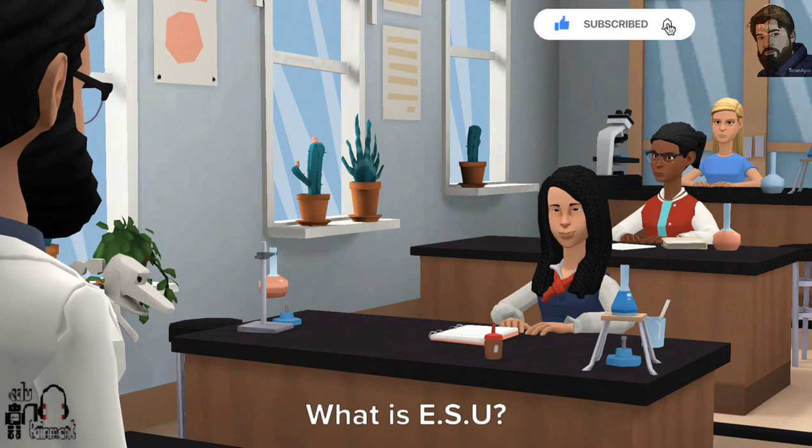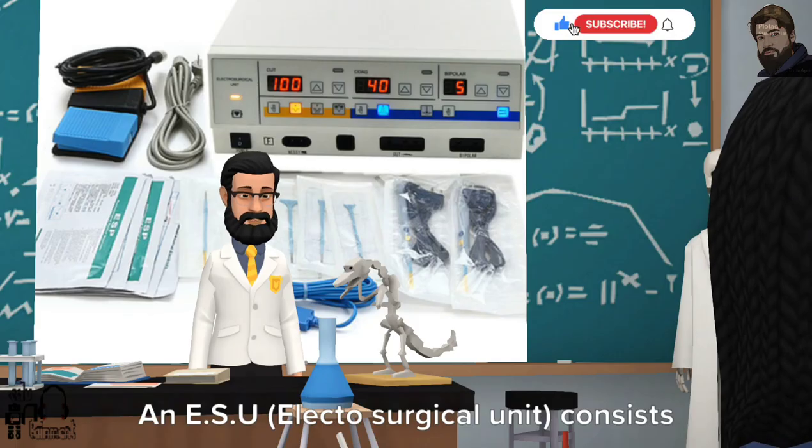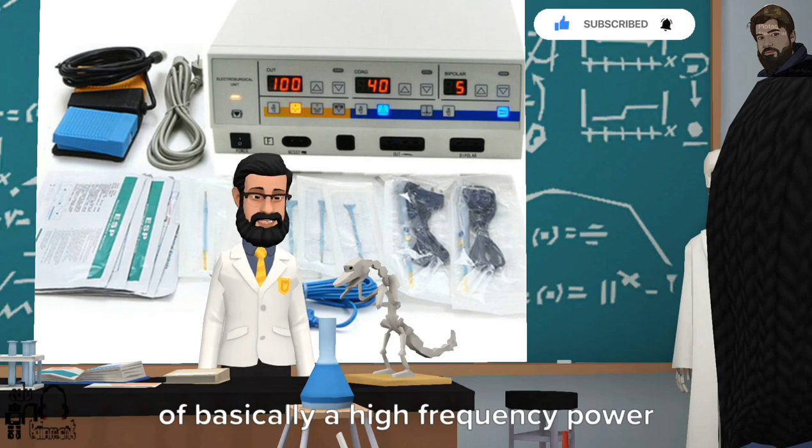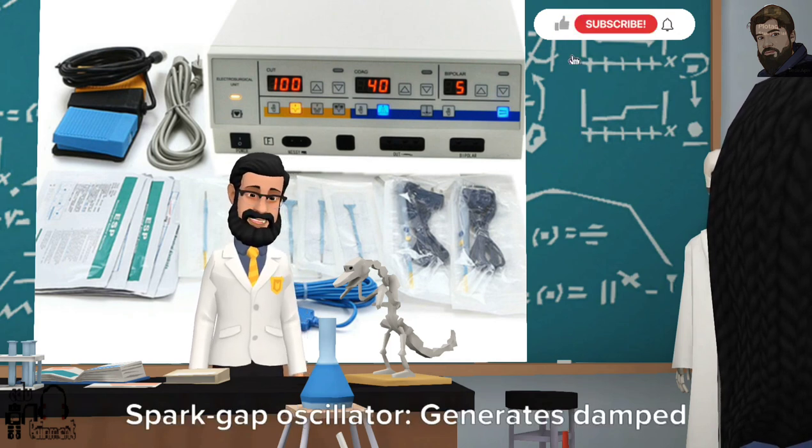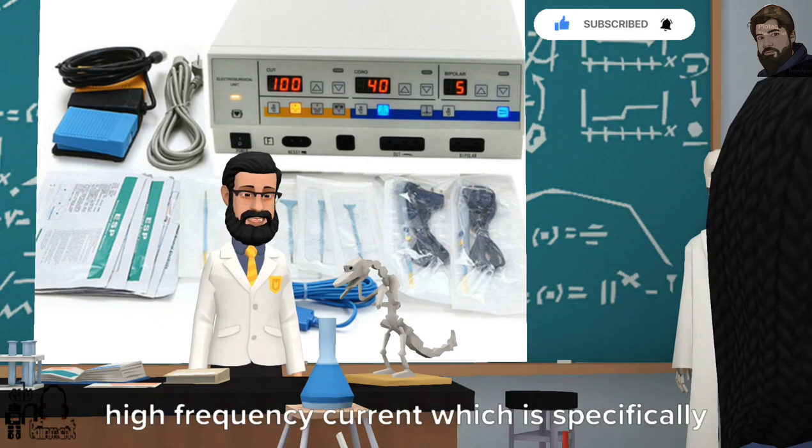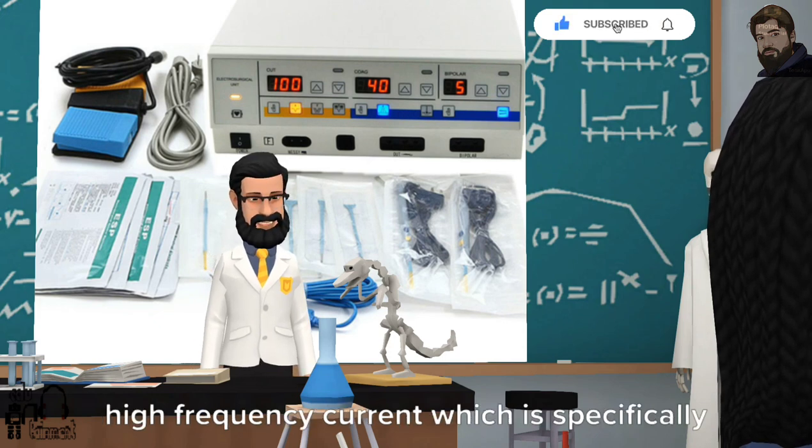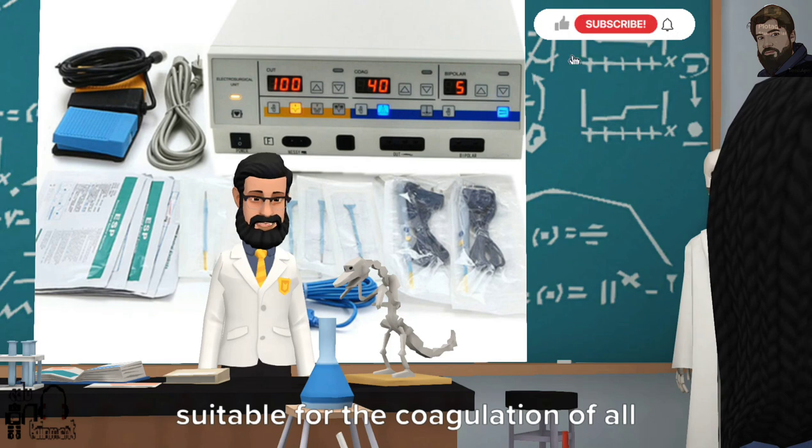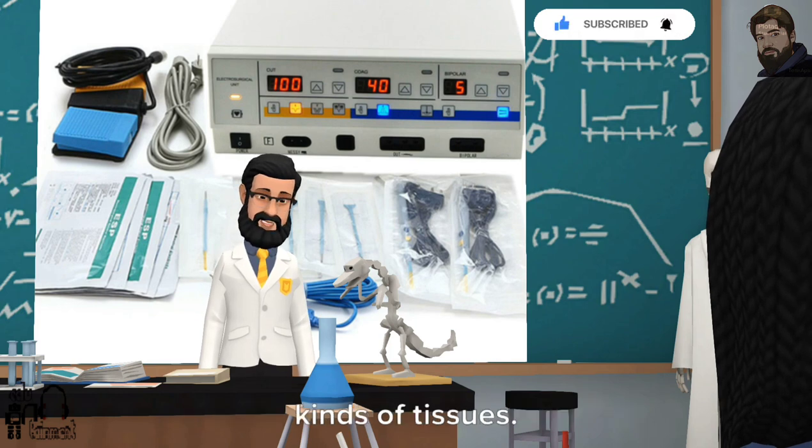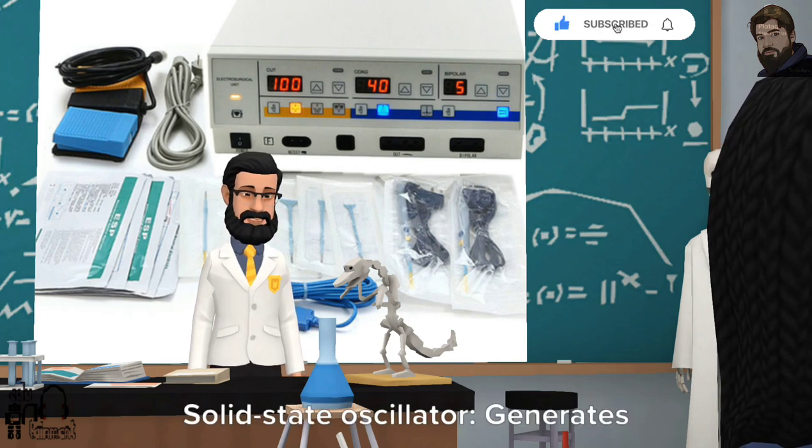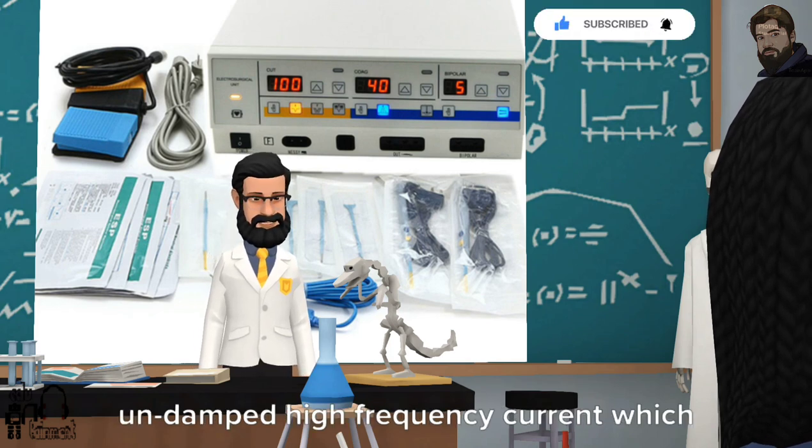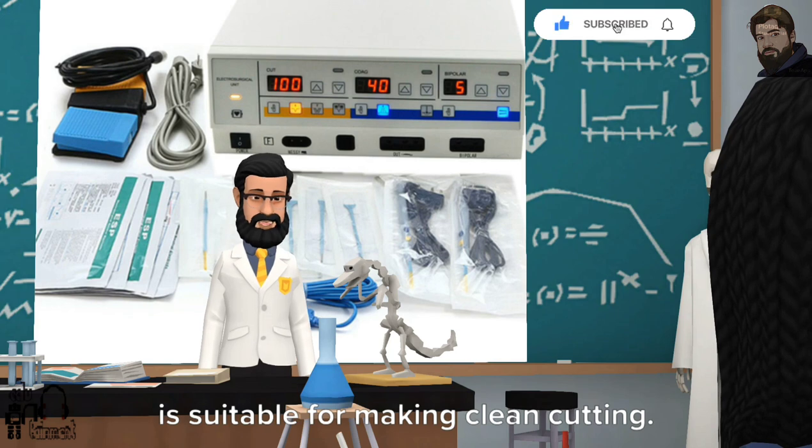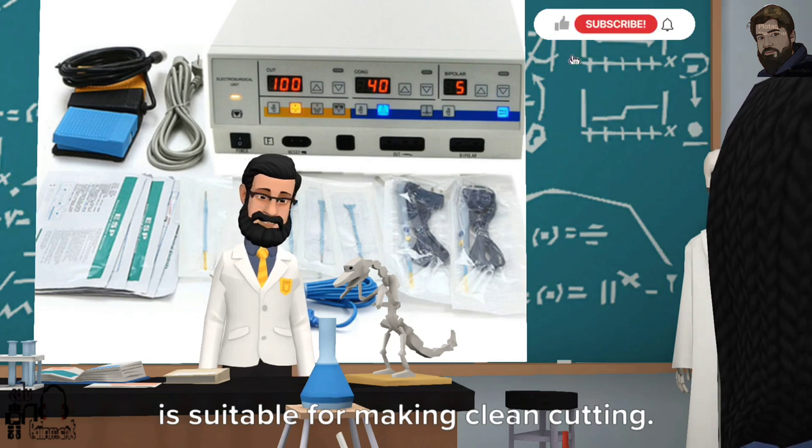What is ESU? An ESU, electrosurgical unit, consists of basically a high-frequency power oscillator. Spark gap oscillator generates damped high-frequency current which is specifically suitable for the coagulation of all kinds of tissues. Solid state oscillator generates undamped high-frequency current which is suitable for making clean cutting.